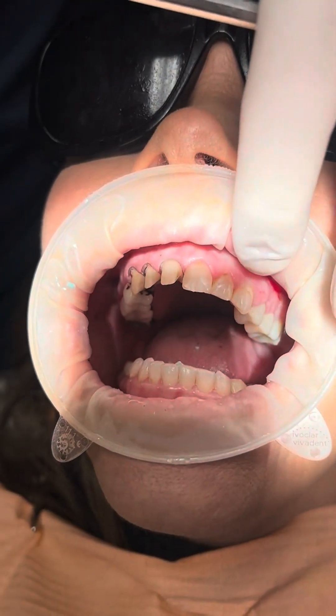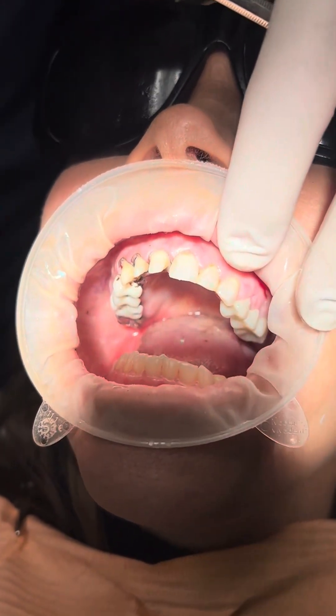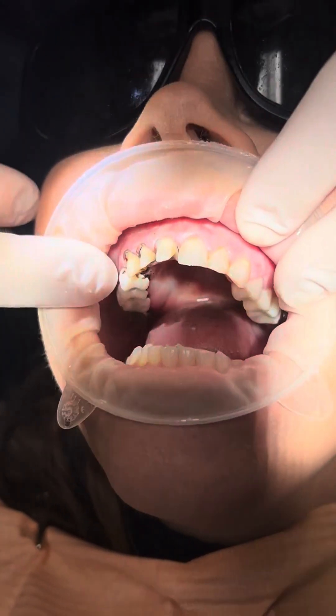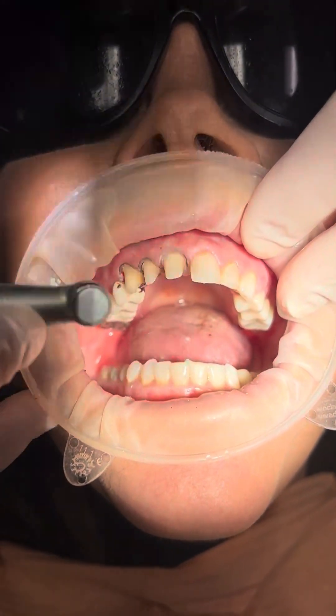Today Ms. Dawn is kind enough to let us video her getting a tooth prepped. We're prepping six teeth. She's got composites in all these teeth and she wants a new smile. So we've got six, seven, eight already prepped.